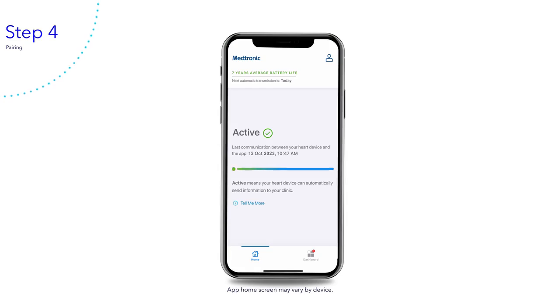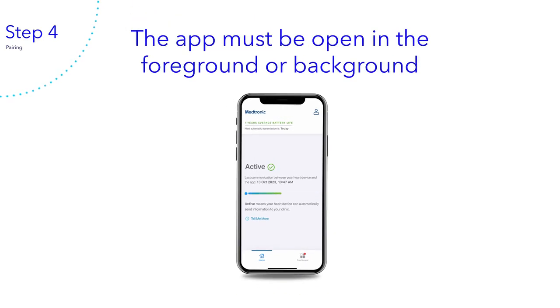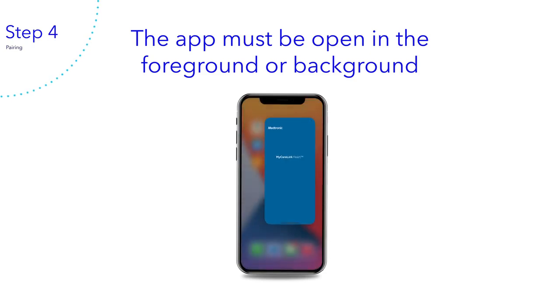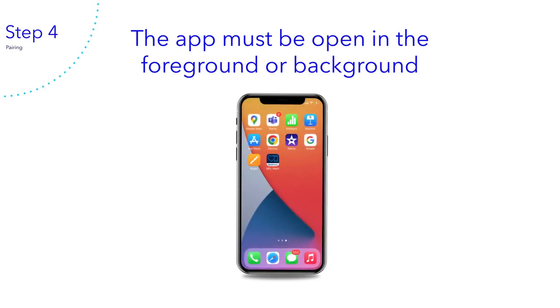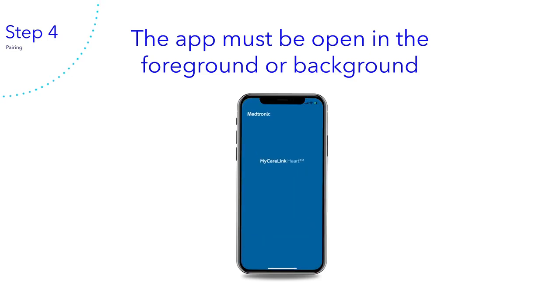You will see the home screen when you have successfully completed the app setup and you are connected to your clinic. To continue automatically sending your heart device data to your clinic, please keep MyCareLink heart open in the foreground or background — do not close the app. If you happen to close the app, open it again and you will be reconnected to your clinic. The app will also send you notifications reminding you to reopen the app if you forget.